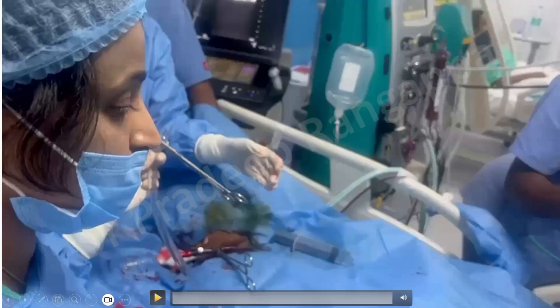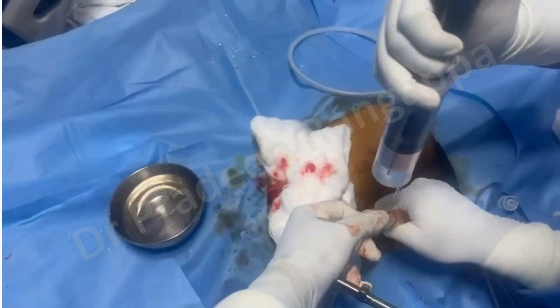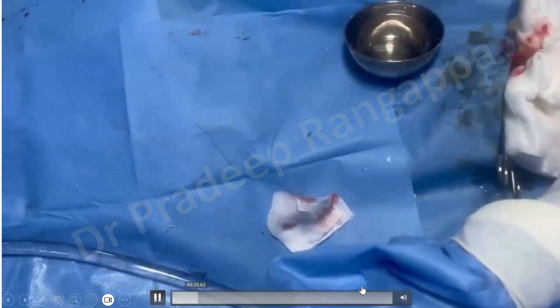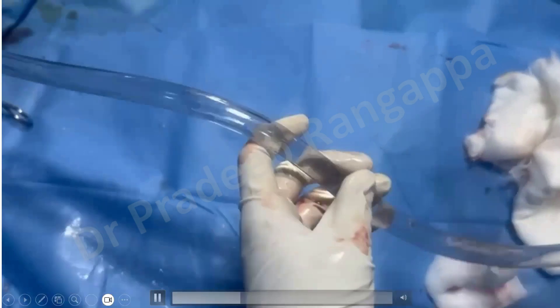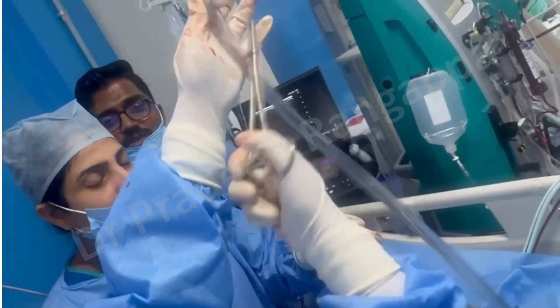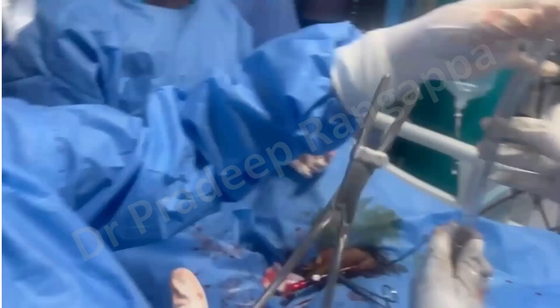Here is the three-minute video of how we performed the VAV ECMO. Our ECMO fellow is placing a right IJV ECMO cannula. You can see the femoral cannula where a Y connector is connected. There is a Y connector — one arm goes to the femoral artery and the other goes into the internal jugular vein. Super-oxygenated blood flows to the femoral artery and 50% of the blood is directed into the right IJV. This is the hybrid ECMO.